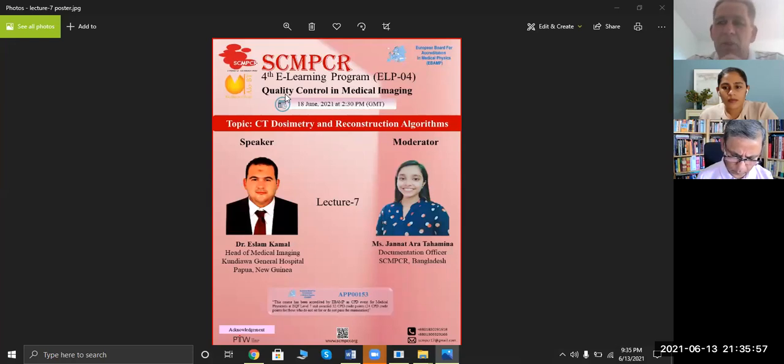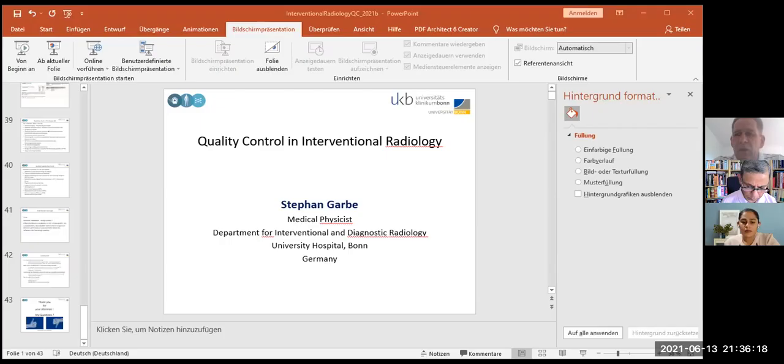Very important. If he's satisfied with a low dose image because he could see everything, that's fine. But it's always a matter of how experienced your user is with the low dose images. Some of them tend to feel they are too noisy. The problem is what would they like to see?